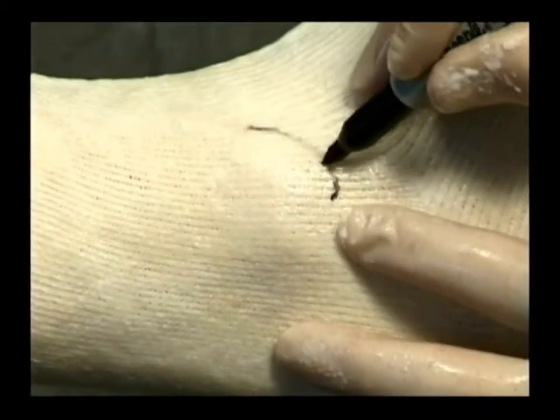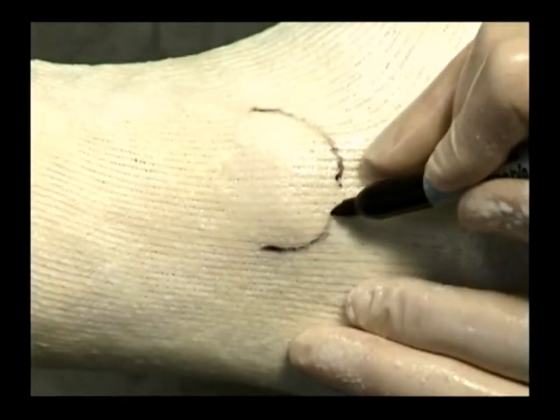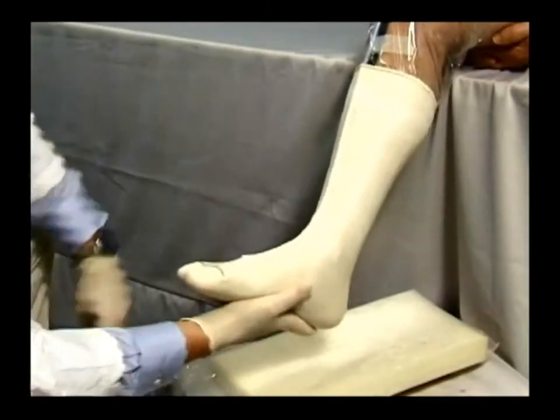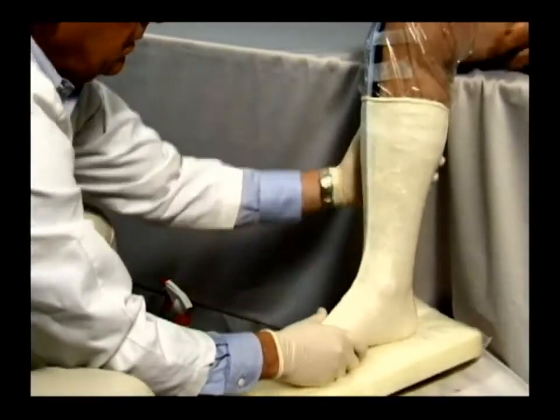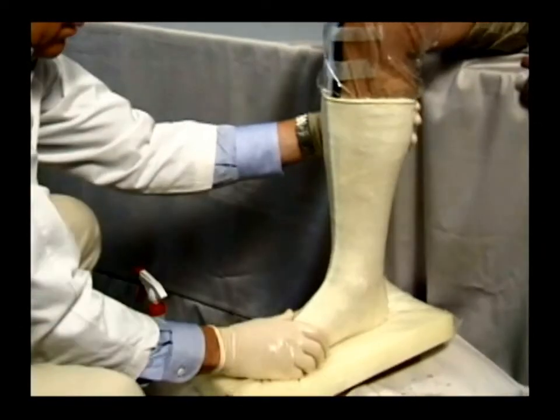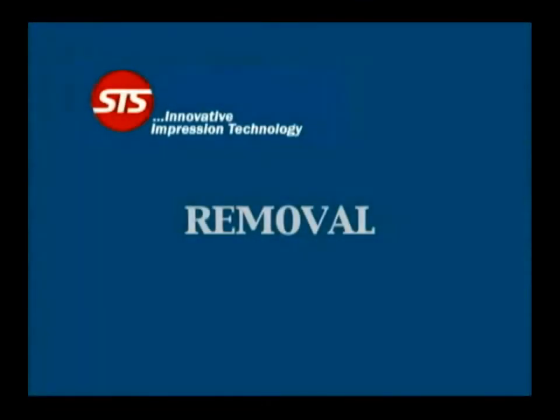Some fabricators require the distal tip of the maleoli be marked; use a felt tip pin to accomplish this. If a weight-bearing or semi-weight-bearing cast is desired, place the patient's foot on a casting platform or casting pad of soft foam covered by a sheet of plastic wrap such as saran wrap. The plastic wrap will prevent the resin from sticking to its underlying support. When the mold is completely rigid and is no longer tacky, it is ready for removal.